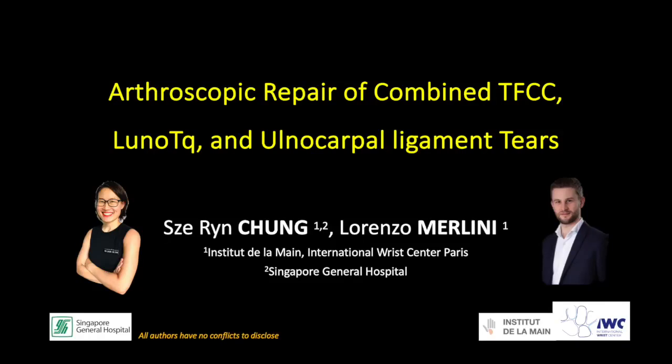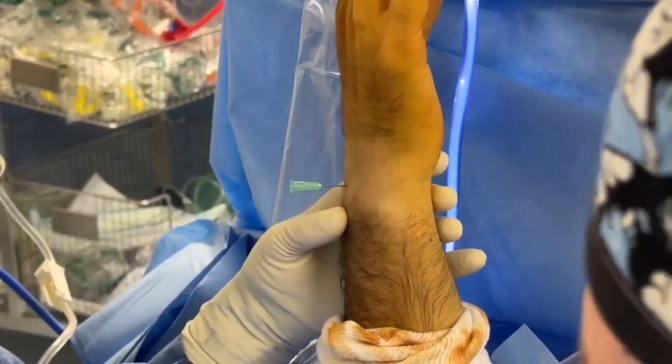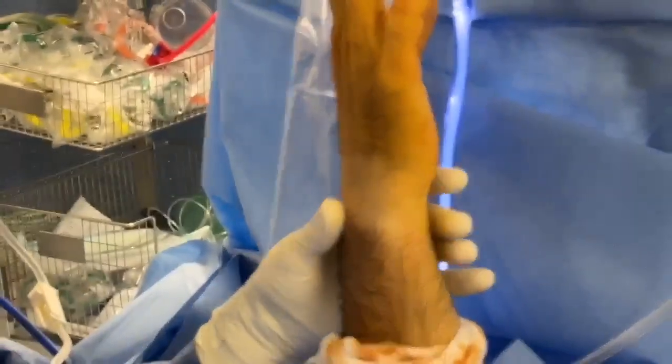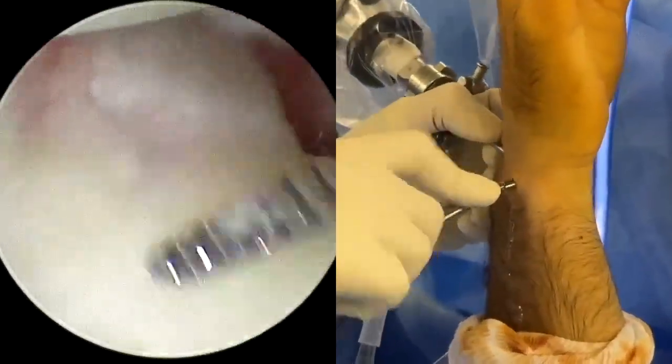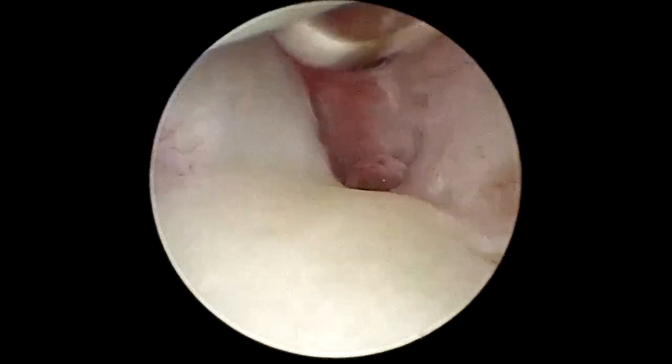We describe an arthroscopic repair for combined TFCC, lunotriquitral, and ulnar carpal ligament complex tears. This procedure is performed under regional anaesthesia with a tourniquet and a standard wrist arthroscopy setup. We begin with the radiocarpal joint assessment.